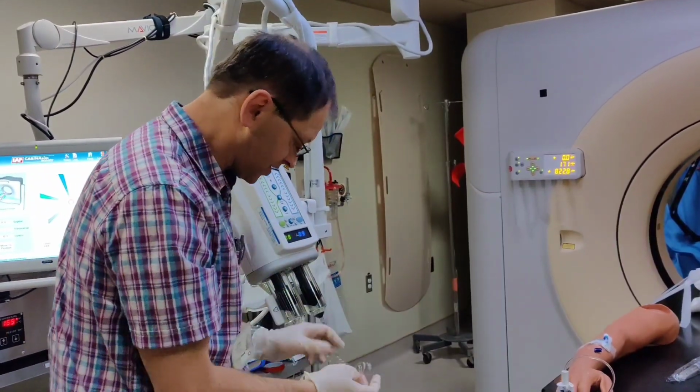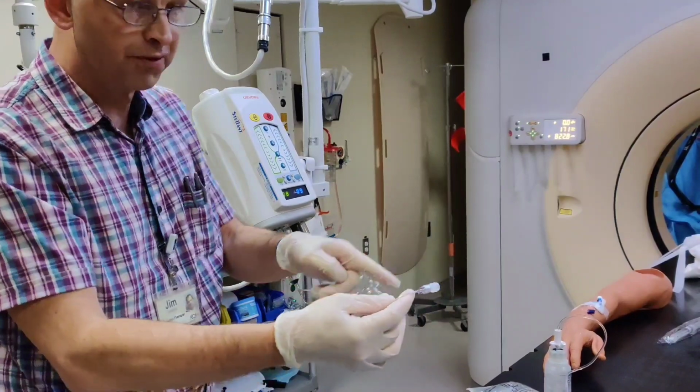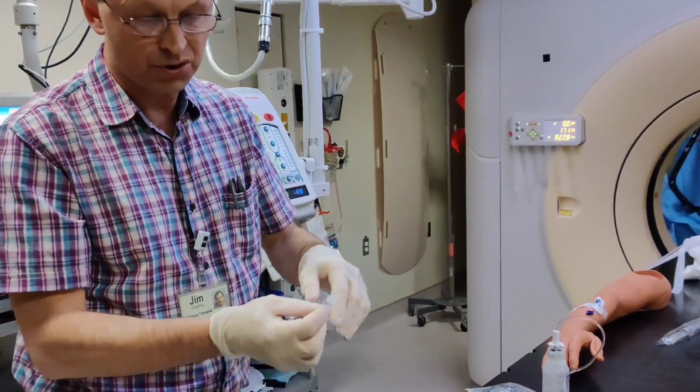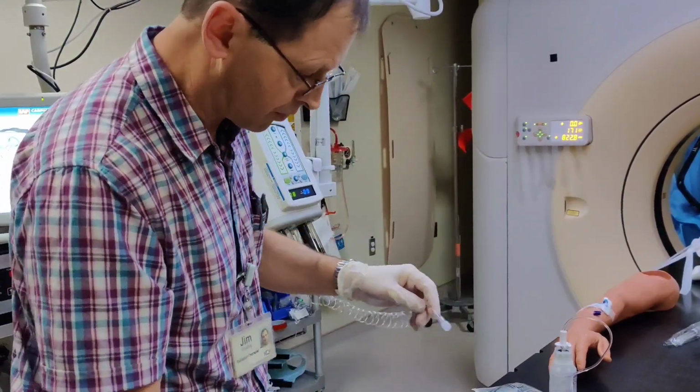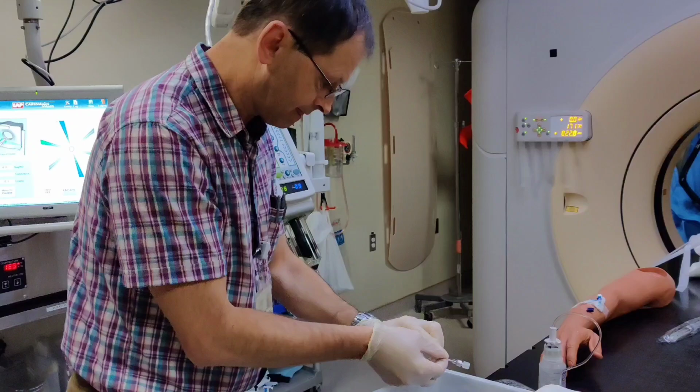We need to prime the system. So basically what we're doing with priming is we're removing all the air from the line to the end, and then this end is what will connect to the patient, which we'll do in the next step in the video. For this part though, you can use your basin here.